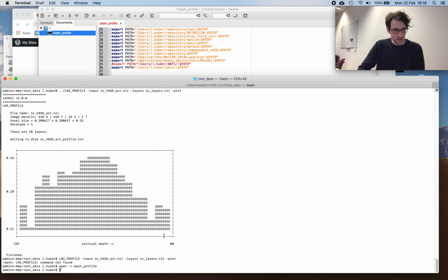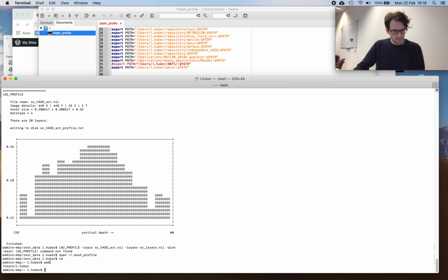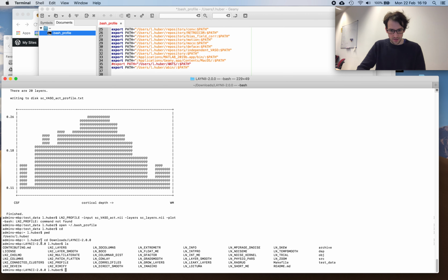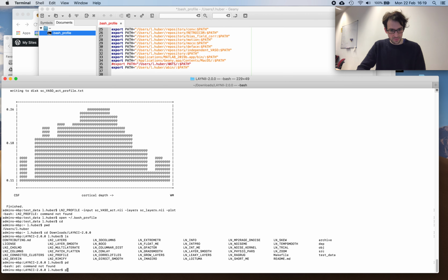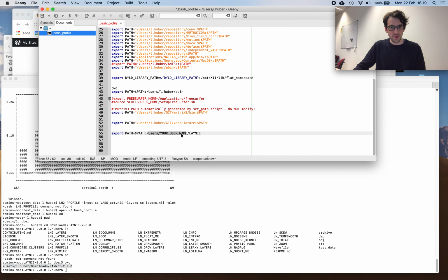So let's see where our binaries actually are. I think I made a wrong turn there. This is where the binaries were, and in PWD this is our path, so let's copy this one and put it right in there. Let's save it. You can, by the way, store them anywhere. Usually you don't want to store them in your downloads folder, and this is just now for convenience.